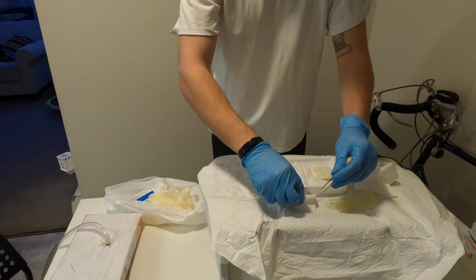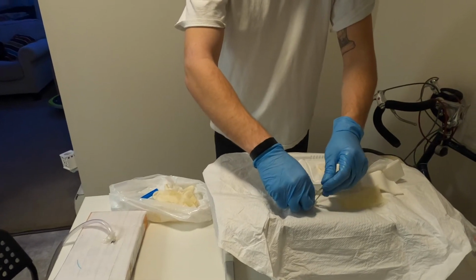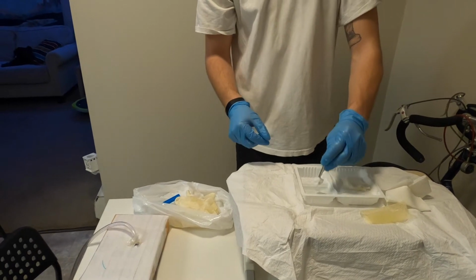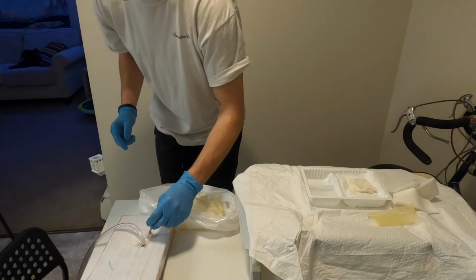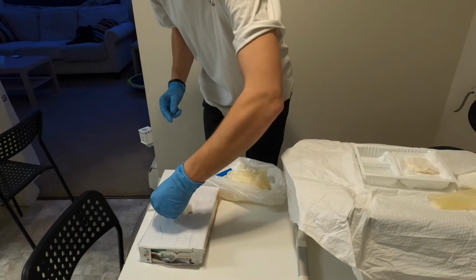I can use my sterile gloves to make the rosettes. And I'm trying not to lean over my sterile field too much here. Good. And now a little further around the peri wound.